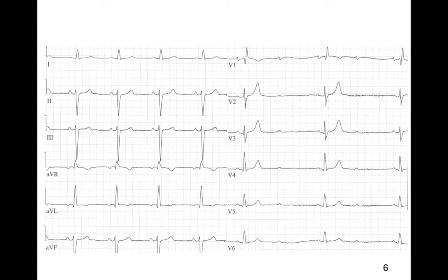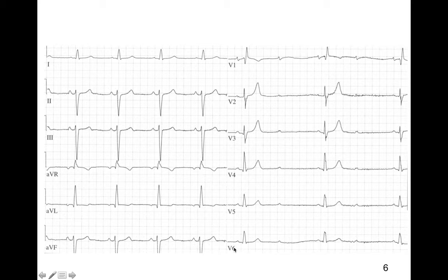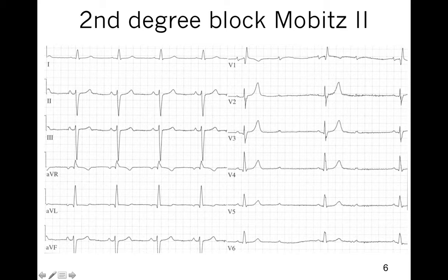Please interpret this ECG. This is an example of a P wave followed by QRS — P wave, QRS, P wave, QRS — with no prolongation of the PR interval. And then suddenly there is a loss of a QRS complex. So most P waves conduct, some don't, with no prolongation of the PR interval. This is second-degree block type 2, or Mobitz 2.